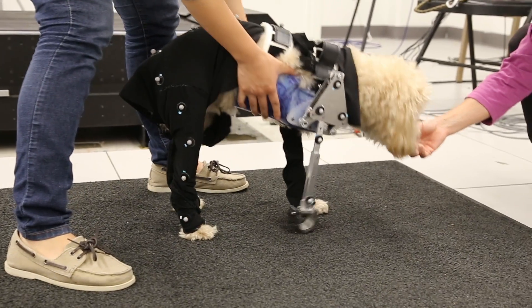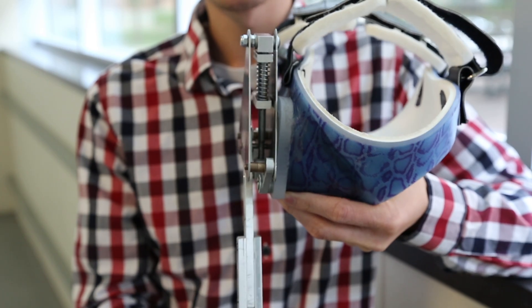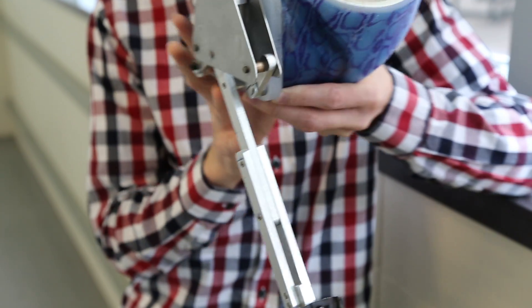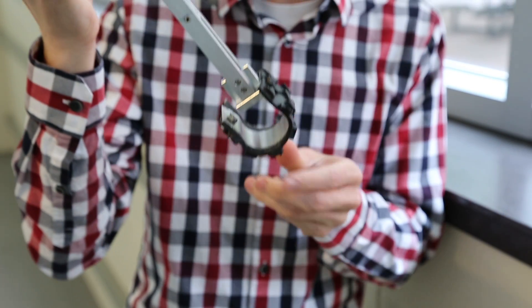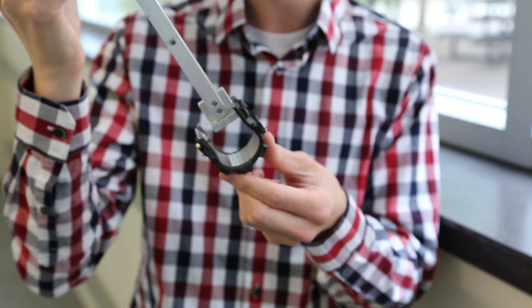The unique thing about our bionic leg is this spring system you can see in here — this is what propels the front leg forward. We kind of mimicked a Blade Runner style, similar to Derby, and that's how the foot was designed.